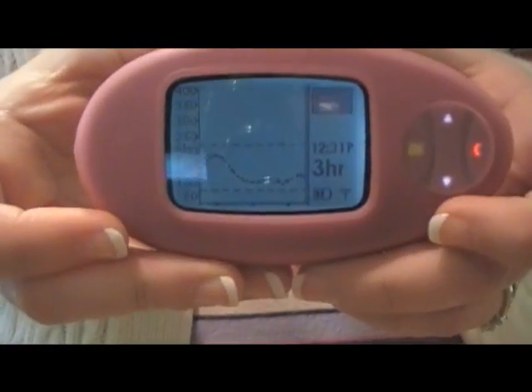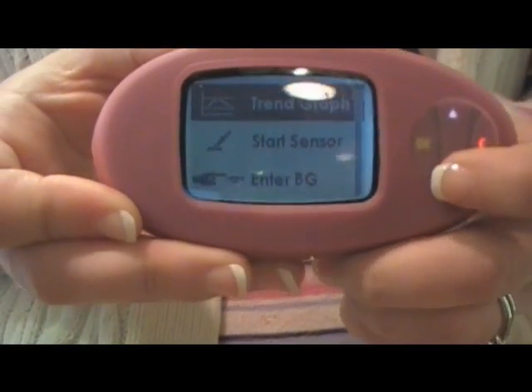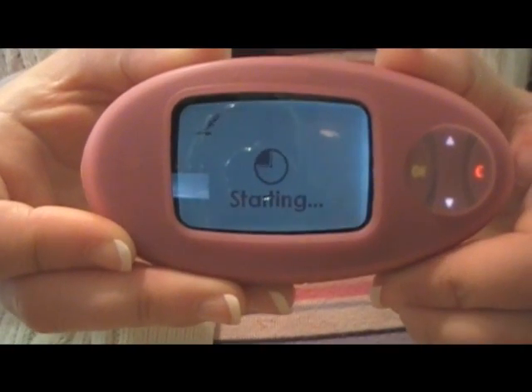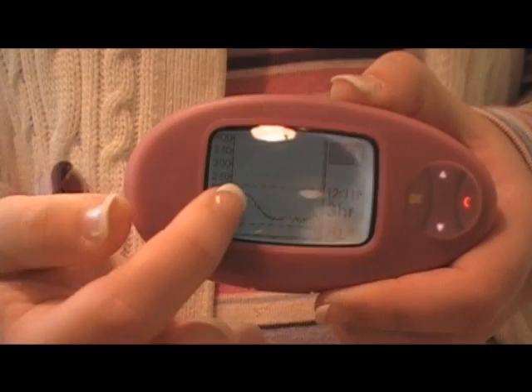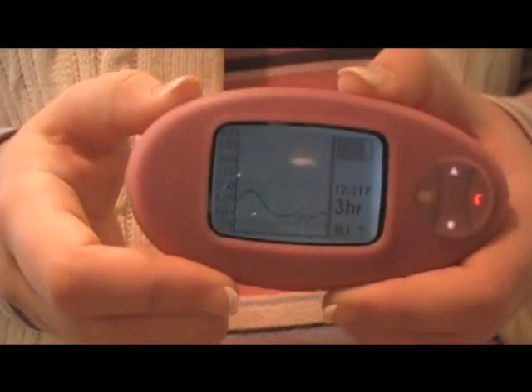Then you go to your Dexcom, turn it on, go to OK, go down, and tell it OK to start the sensor. And it says 'starting.' Right here is where it paused — this is my reading before, and then it paused. In two hours, this will be mostly grayed out, and then that's when it'll tell you to enter your startup glucoses.